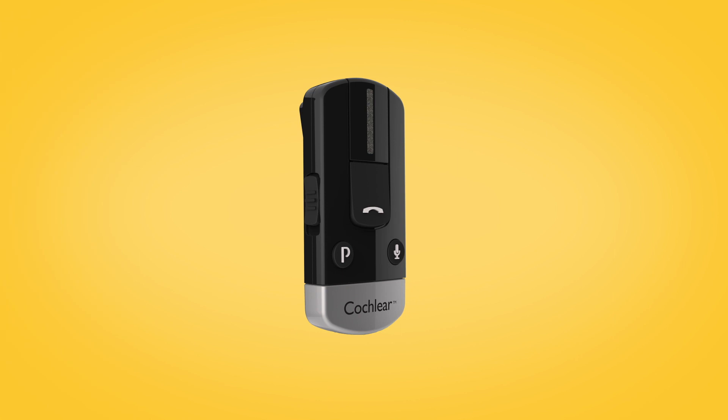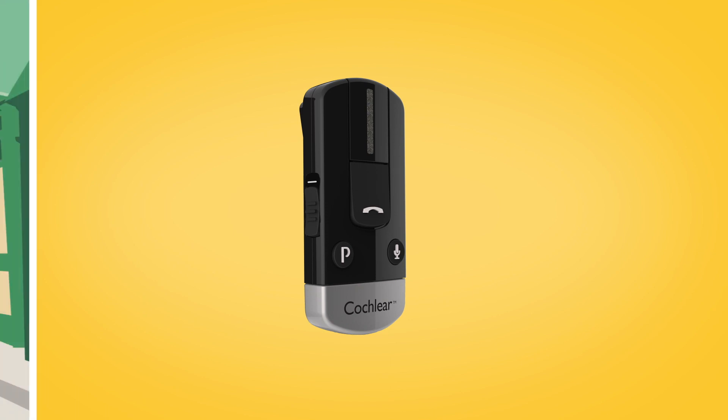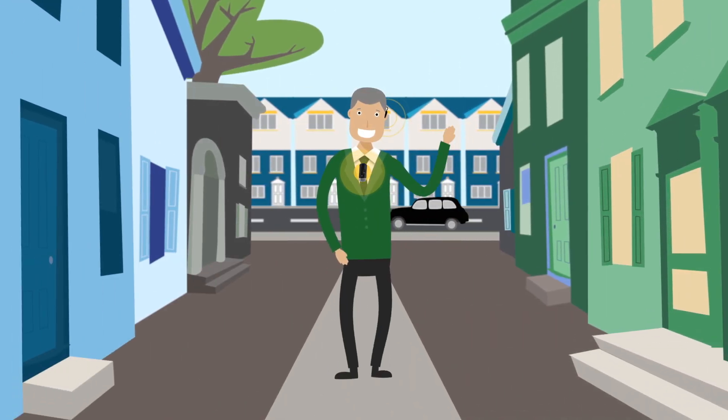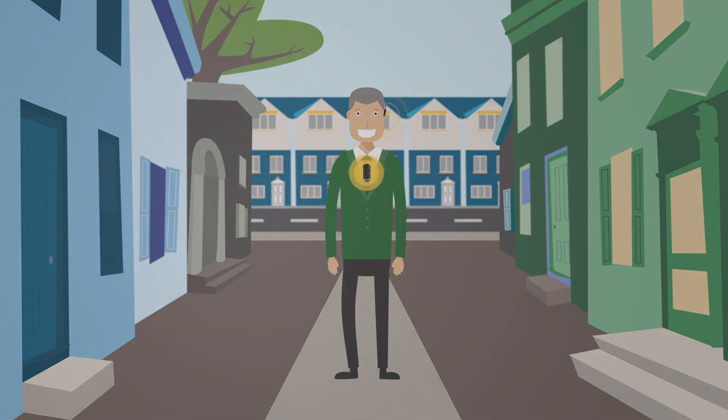To start streaming audio, simply turn on your phone clip. When audio starts playing from your Bluetooth enabled device, it will automatically stream audio to your sound processor.